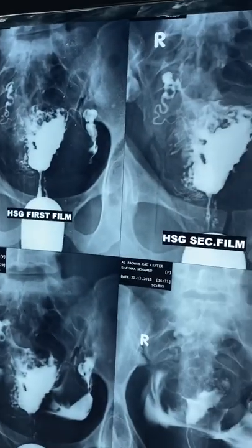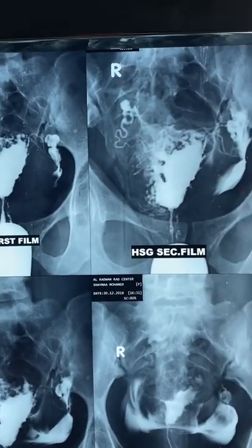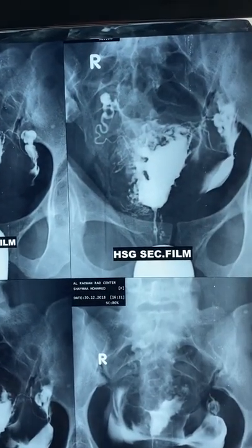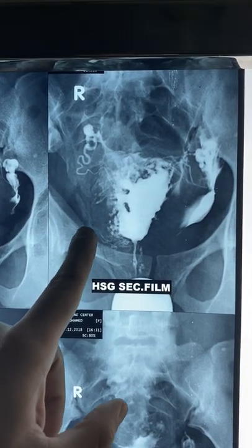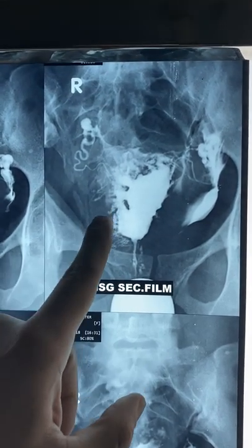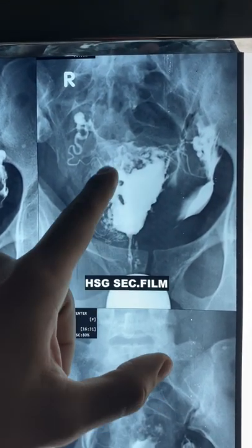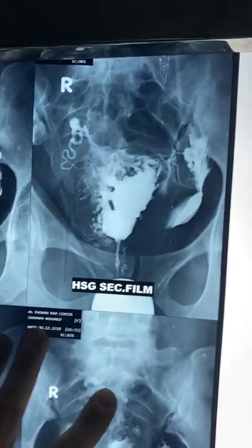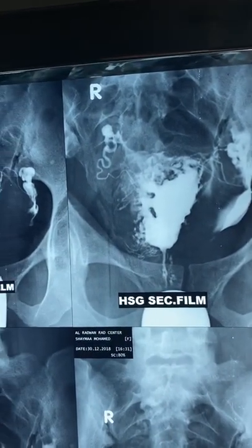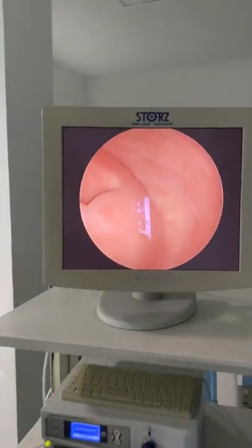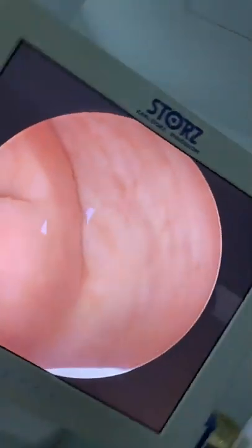Welcome everybody. This is a case of intrauterine adhesions. You can see here from the hysterosalpingography — in the right aspect of the uterine cavity there seem to be adhesions, also at the level of the fundus. This is post-abdominal myomectomy, and we are going to shift to the hysteroscopic view.